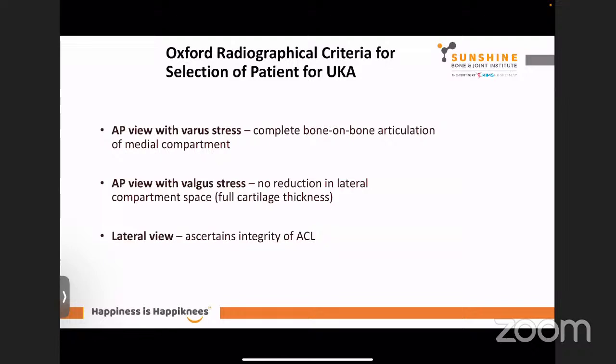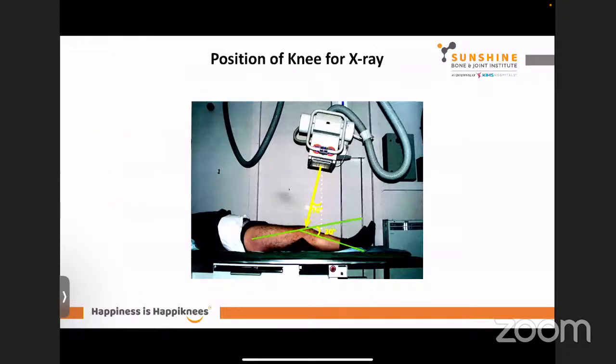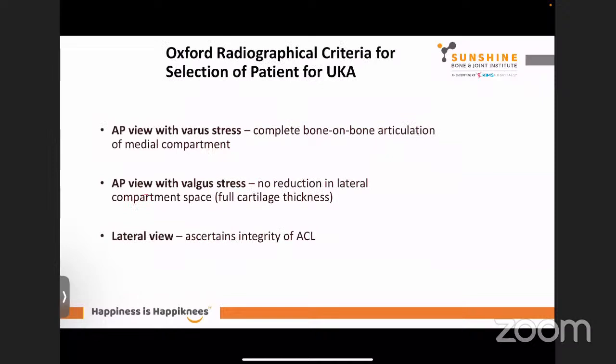Now the next important thing you have to know about is the Oxford radiological criteria for selection of patients for unicondylar arthroplasty. You have to take an AP view in a varus stress, an AP view with the valgus stress, and a lateral view. In varus stress, you should see complete bone-on-bone articulation of the medial compartment, so there should be loss of complete medial joint space. The valgus stress should show no reduction in the lateral compartment space.